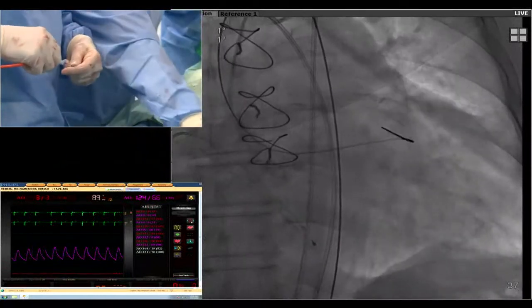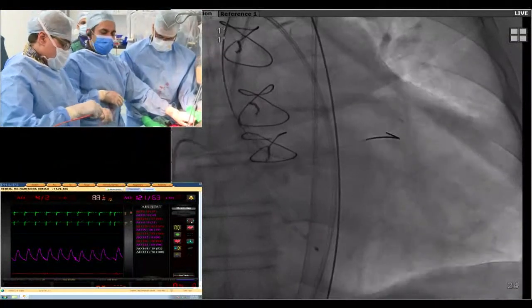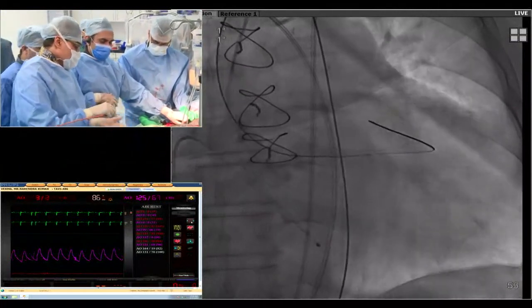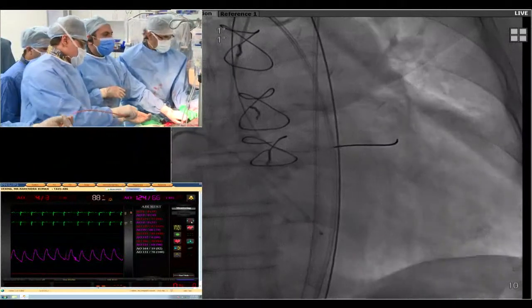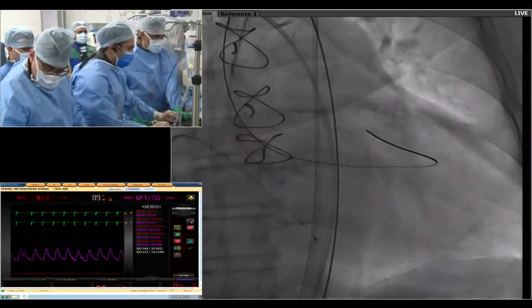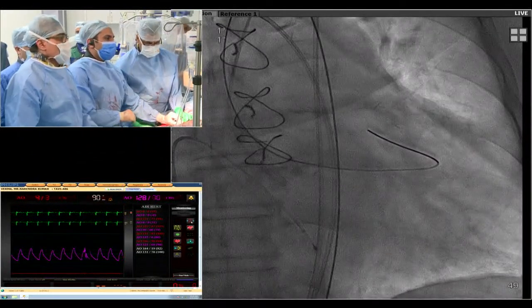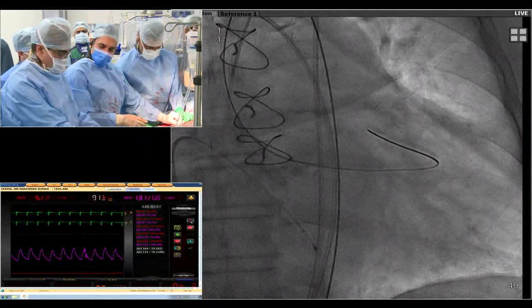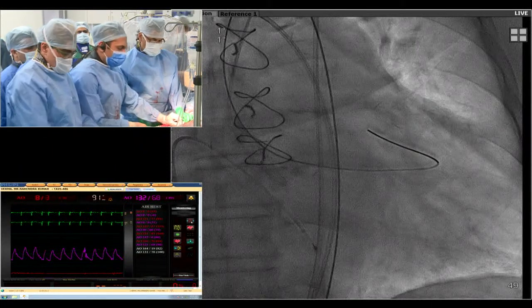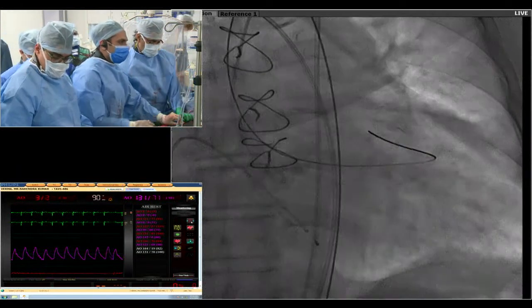You want to make it wet more? We're going to talk about some very interesting things. You might be wondering, there are so many catheters up there in the arch. We have two guide catheters and a pigtail in the arch, and this whole thing might interfere with the arch. But as you might be aware, there's a very interesting property of the Navigator where we can flex it, and it's going to stay away from the arch. So let us see how it goes.